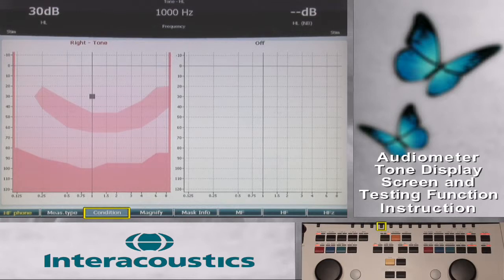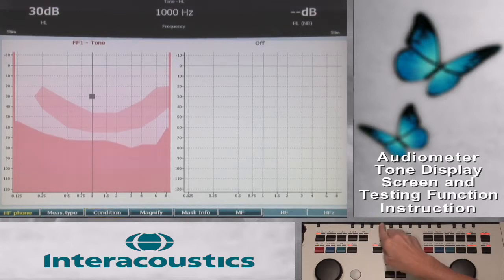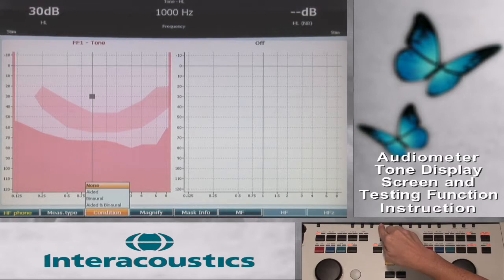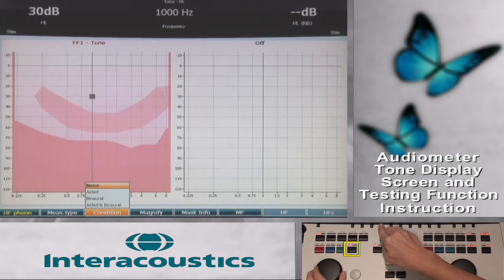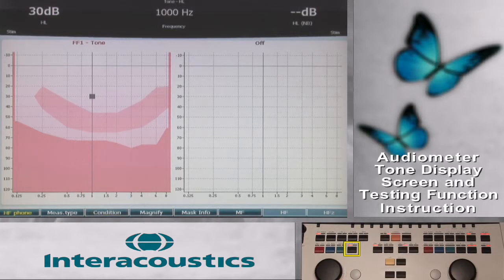The Condition function key allows for aided and binaural storing of results with an A or B display on the audiogram. At this time, this function key is only active when the transducer selection is FF1 or FF2, but future developments are in place to allow the notation with other transducer selections.